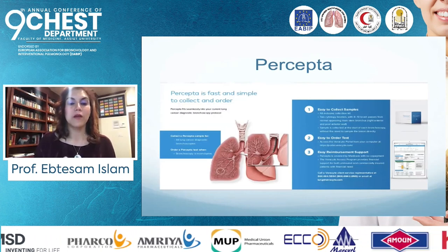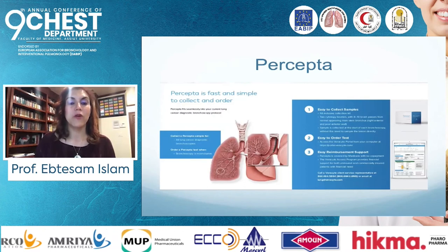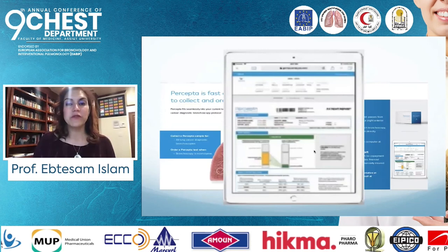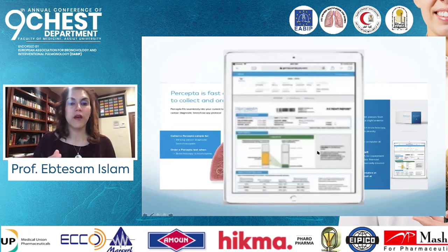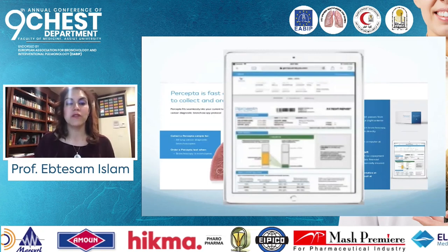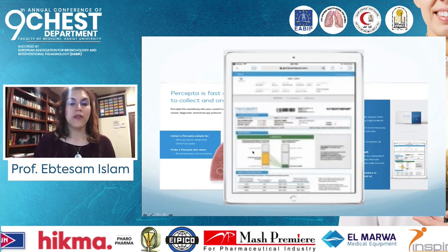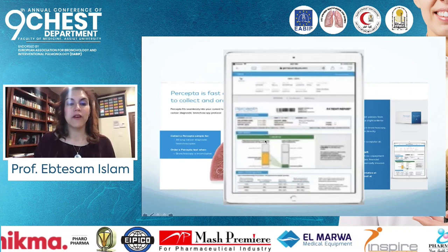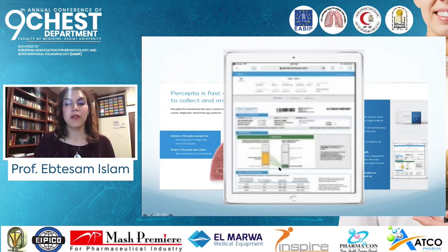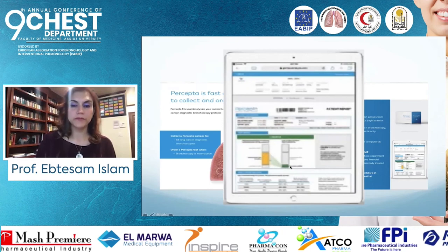And the idea is that they will send me back whether, from the sequencing, this patient is low, intermediate, or high risk. Prior to the procedure, I do fill out a form that states how long the patient has smoked for, and my assessment of whether I think the patient is low, intermediate, or high risk. An example here is that the physician has classified this patient as intermediate, but when they sent off the Percepta, it came back as a low risk for malignancy.